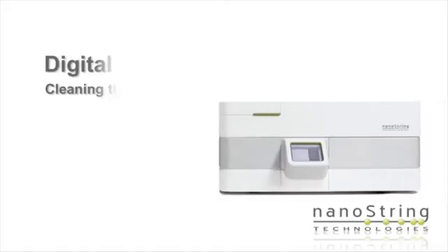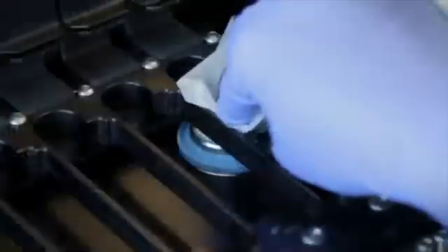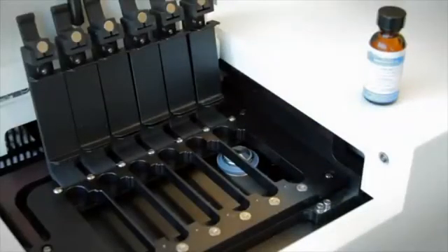There is very little maintenance that's required on the digital analyzer. Excess oil can be cleaned off the stage using a Kim wipe and, if necessary, either 100% ethanol or methanol to dissolve the final traces of oil film off of the stage.